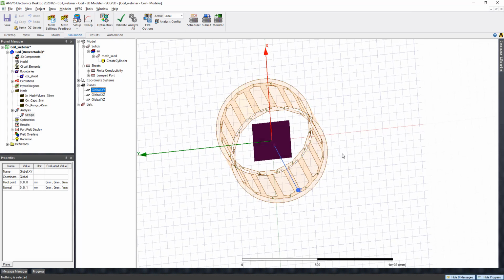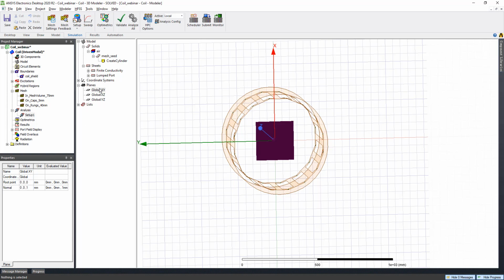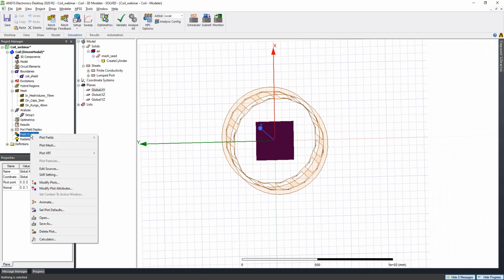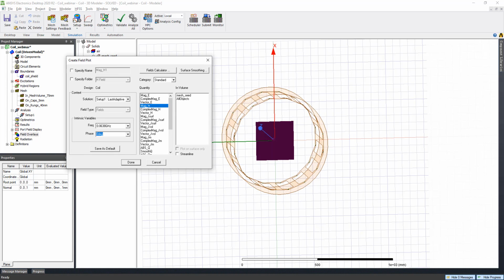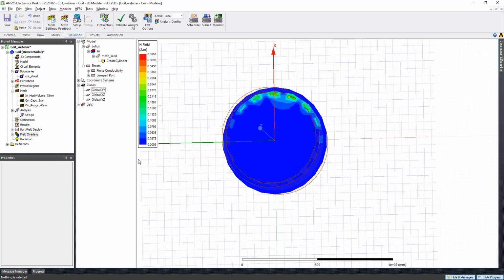I'm going to go ahead and plot the field here. I just select a plane. I'm going to right click on field overlays, plot fields, and I can plot the magnetic H field. Okay, I'm going to select the right frequency, select the right phase, and click done.